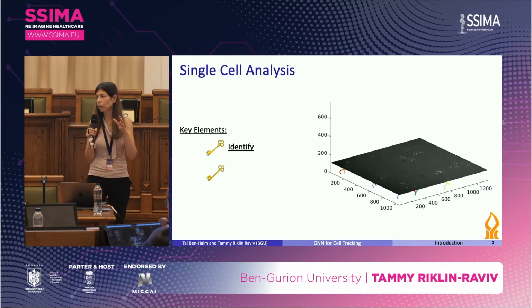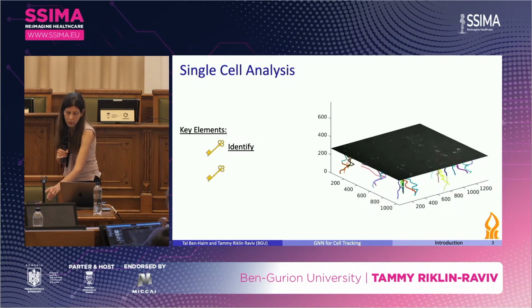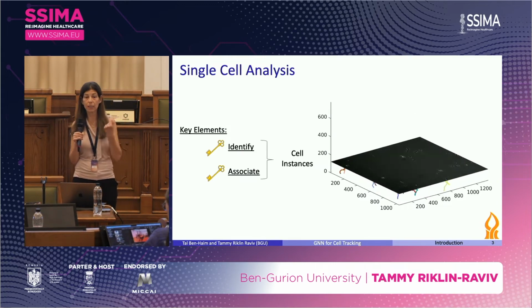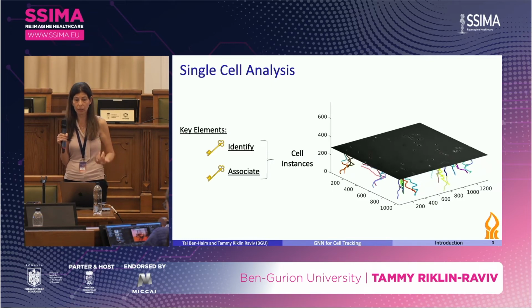Two important aspects in single-cell analysis are annotation or segmentation, and association of cell instances in consecutive frames into single biological cells.